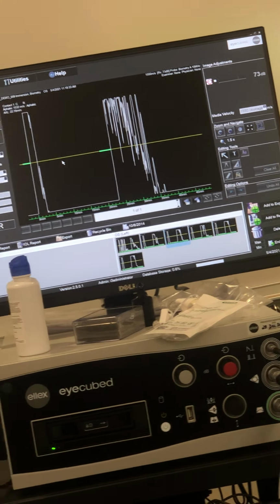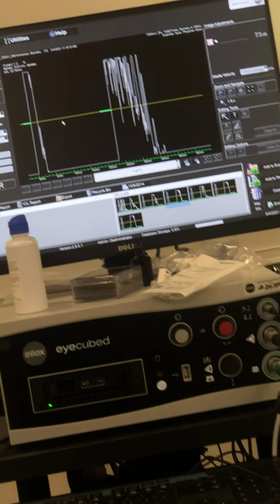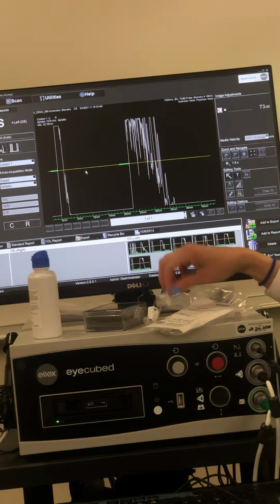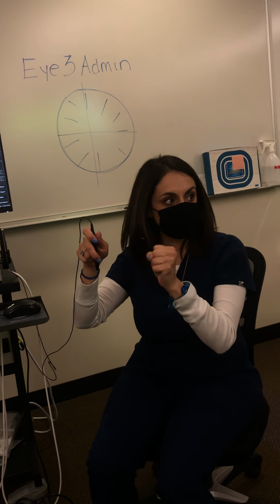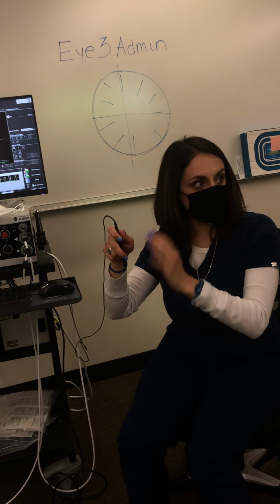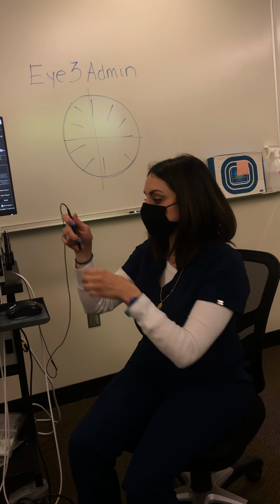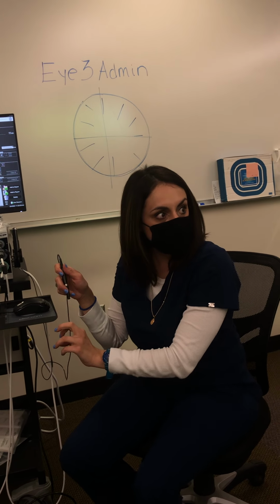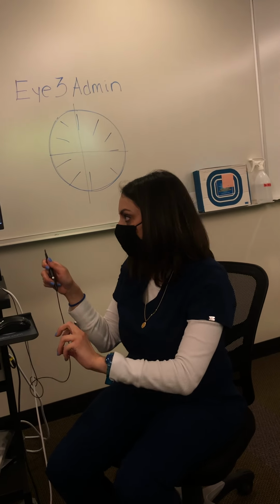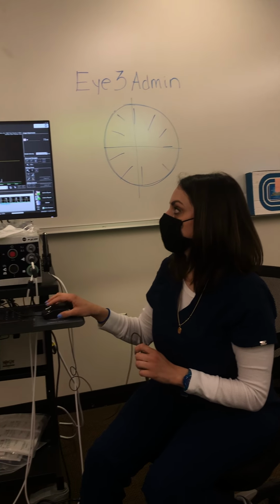So if you have a patient that you know is an easy one, there's no pathology, it's just a cataract, what you wanna do is have this all set up, but have the probe already running. So as soon as you squeeze that water, 1, 2, 3, 4, 5, your images are saved. You don't have to worry about fumbling to get the foot pedal and looking around. It's already running. Squeeze your water and your images are done.